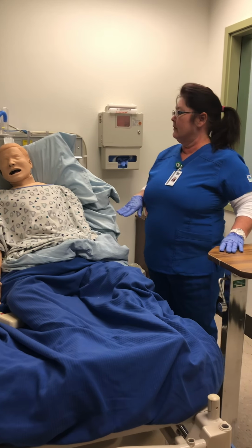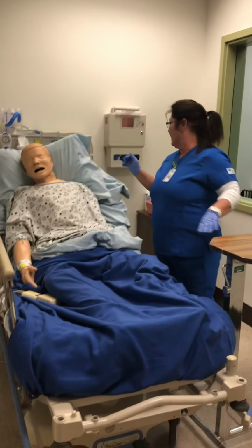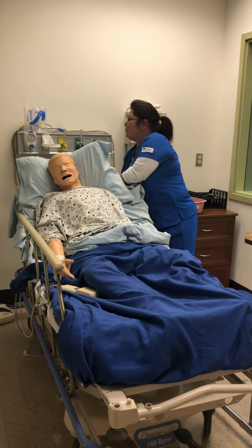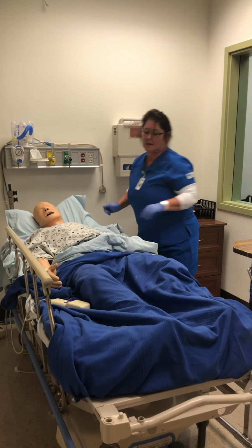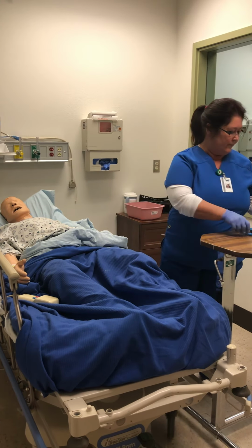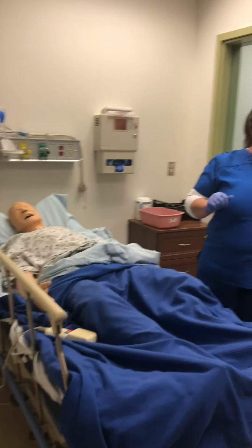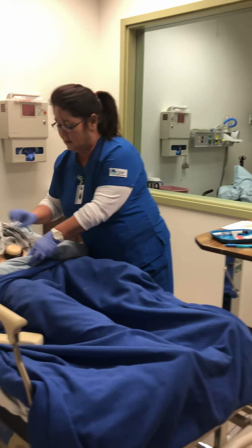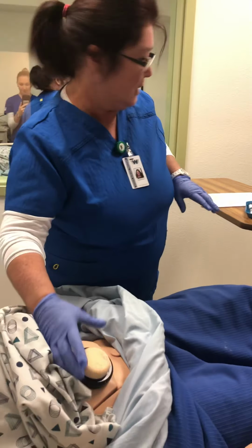Shirley, we are going to give you your insulin. I see that your meal just arrived, so we're perfect. I'm going to lay her back. And I have asked Shirley where she prefers to have her insulin shots, and she says normally at home she does it in her abdomen, so that's where we're going to do it. Okay, so Shirley, we are going to administer first your mixed insulin, and we will do it right here, 2 inches away from the umbilicus.